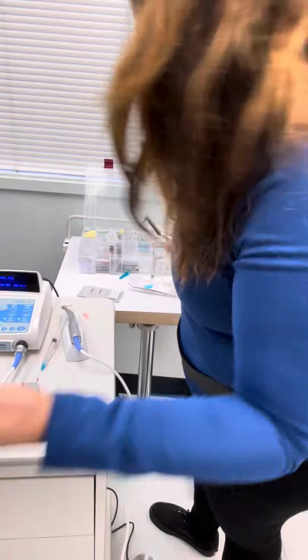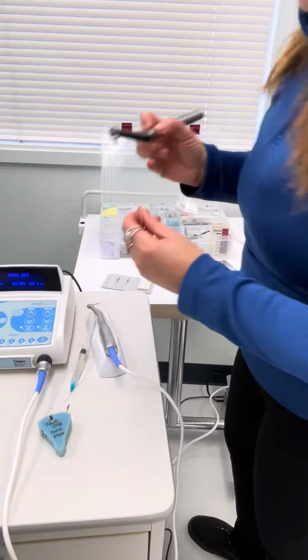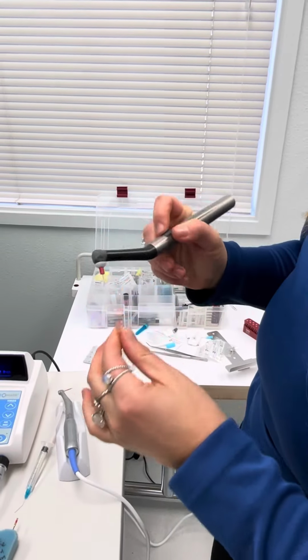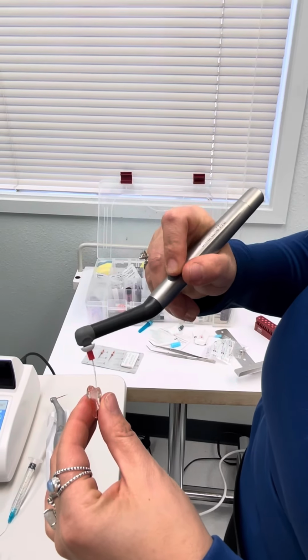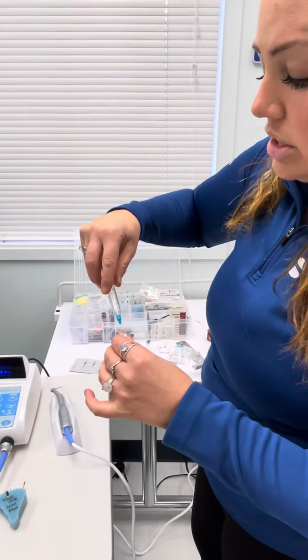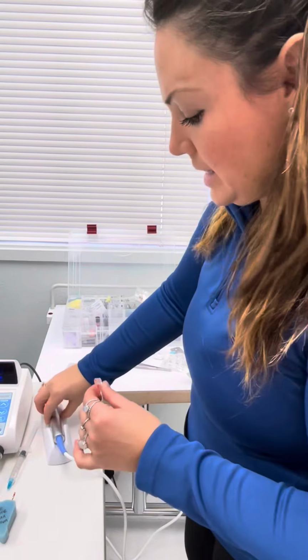Perfect. Awesome. So these guys just snap on there. They're going to go under the tooth and just give it a little whirl. Just breaking up any debris. 8 seconds? Just during the filing, just a little bit to just spice it up a little bit.